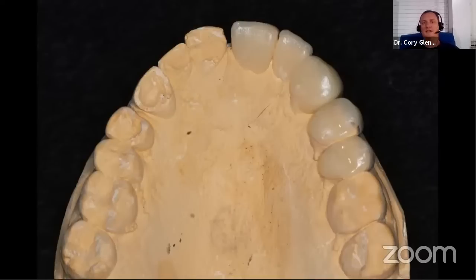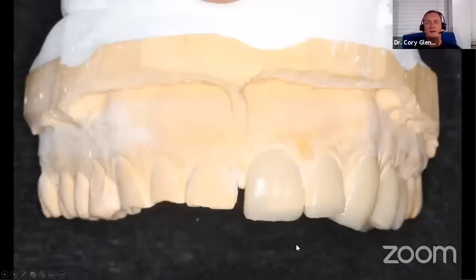And you could have a single appointment full mouth rehab. So you can see this is all additive, and we accomplish a full mouth rehab in a single appointment. And maybe this is not how you want to do a full mouth rehab. It'd be a great option for a budget case, a charity case, something like that.